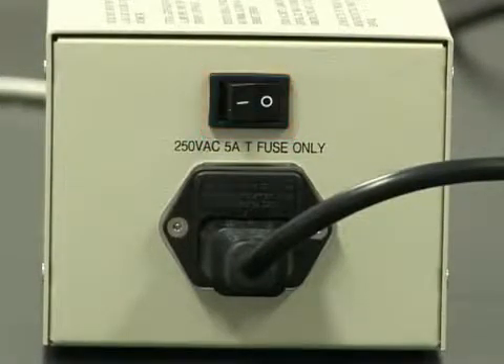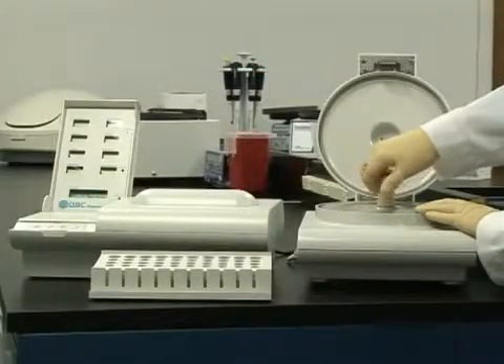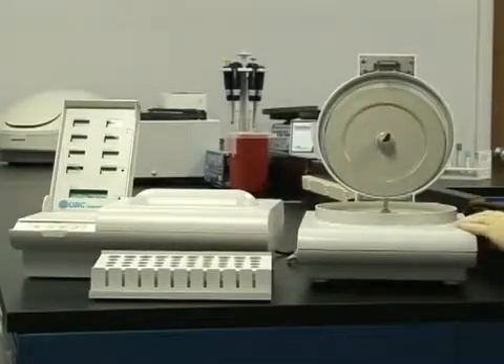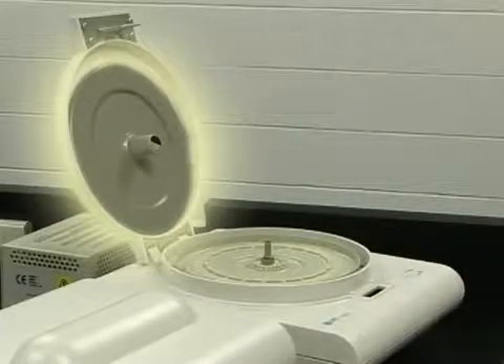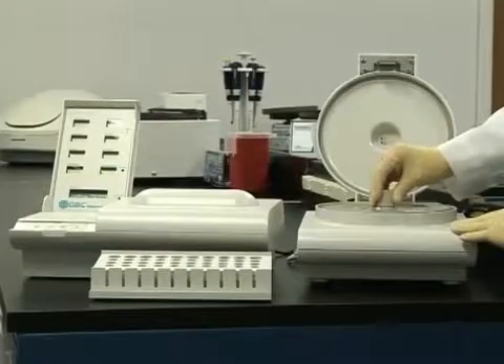To operate the centrifuge, first remove the rotor cover. When taking accutubes in or out, the rotor cover should be placed inside the centrifuge lid. This will remind you to always replace the rotor cover before spinning samples.